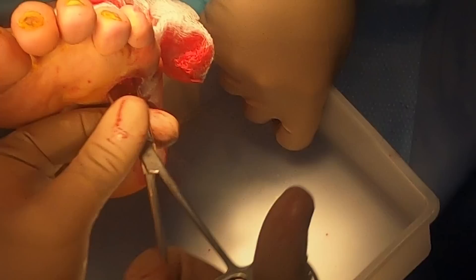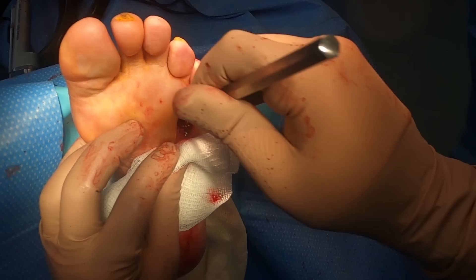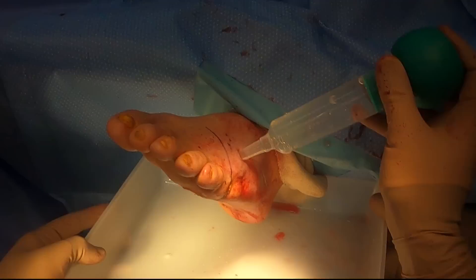It might be better to just take this out in pieces. We already cut a little piece of it and took out the head, as you can see. I still have the remaining shaft of that metatarsal to remove. I freed up all the soft tissue attachments, and voila — there's the remainder of that metatarsal.